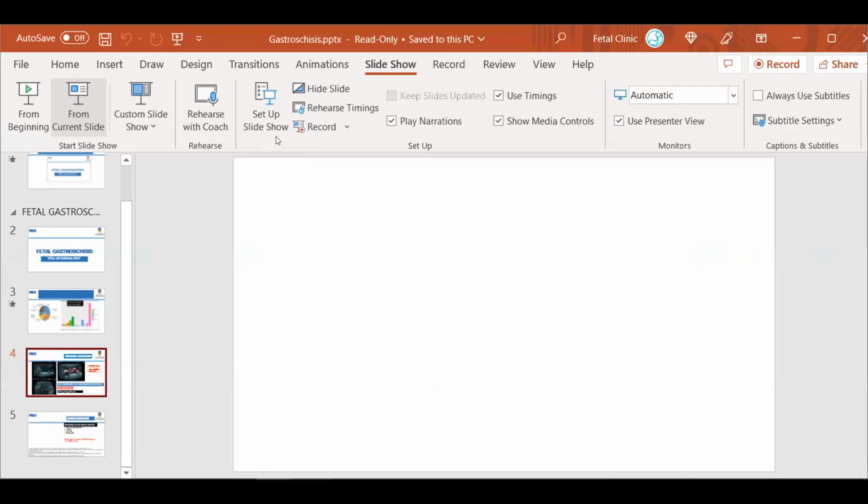So the same with the exomphalos. We cannot miss it if we go and look for those 3 lines. These 3 lines, we identify them when we continue to move the probe after checking the abdominal circumference. So when you do your abdominal circumference today, try to scroll down in a straight line, to just slide your probe in a straight line. Certainly you are going to arrive at the position of the abdominal cord insertion. That's a very important image in screening for abdominal wall defects.